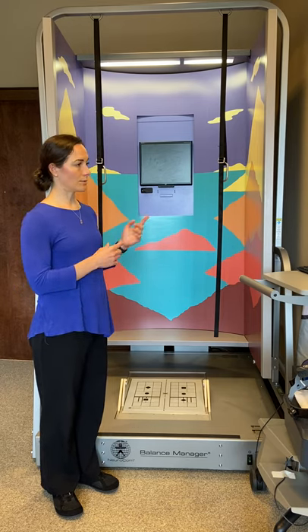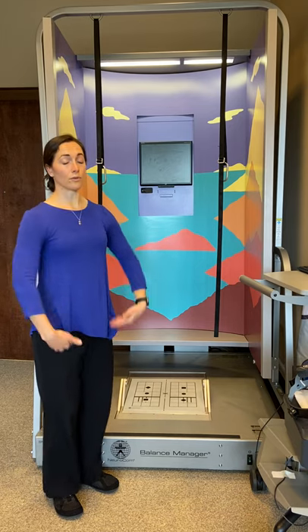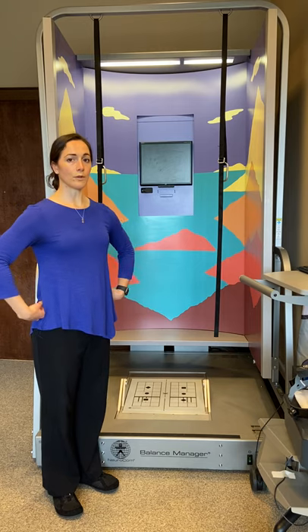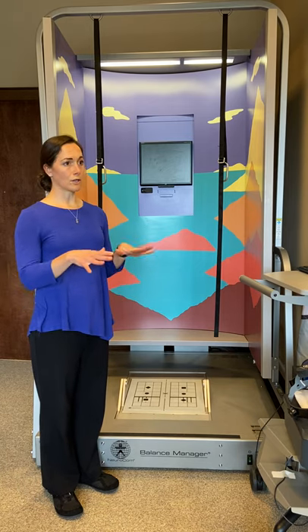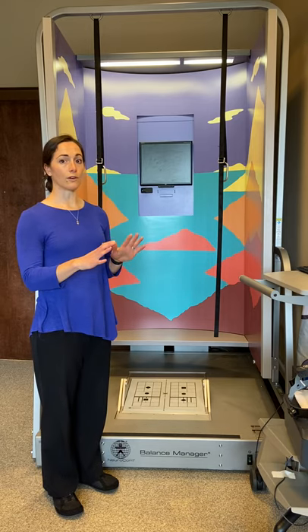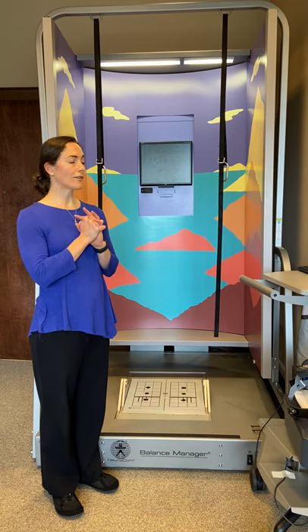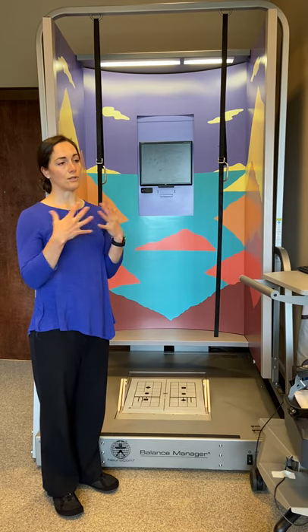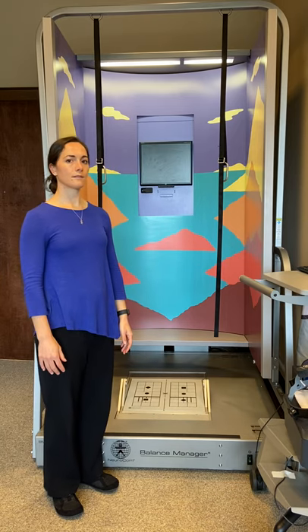A couple of the tests you're able to do with this machine: one assesses the function of the peripheral nerves, so the nerves going from your spine down to your legs and back up. Another test assesses how you respond to quick changes under your feet — like if you step on a rock and it moves under you. And another test assesses your ability to shift your weight in all directions: forward, back, side to side.